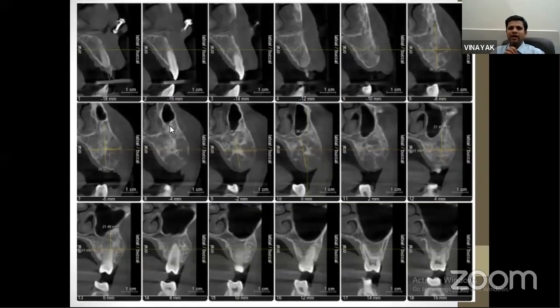This is one case of fibrous dysplasia. So the patient had swelling in the maxilla, only one side, one swelling, and you can see very homogeneous bone, right? And ground glass appearance, uniform marrow, etc. Right? So it is typical of fibrous dysplasia, plateau shape expansion, young female patient with swelling in a single bone.